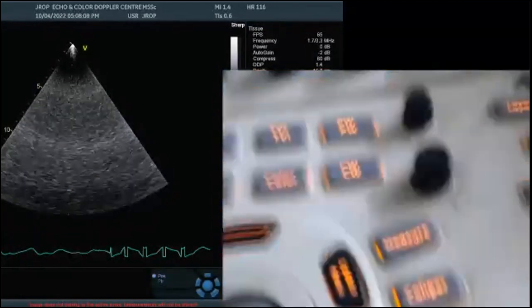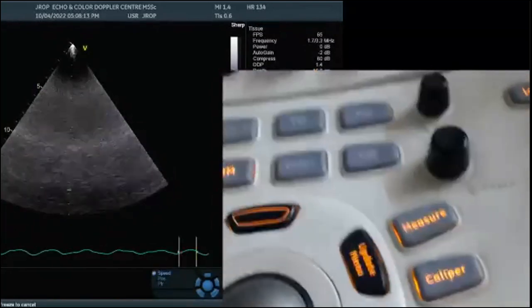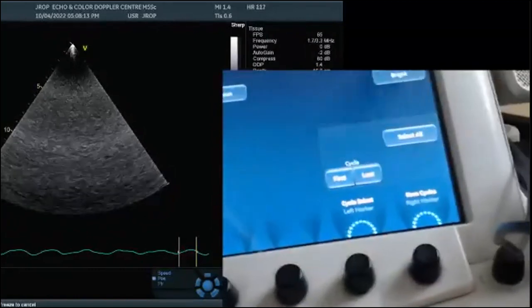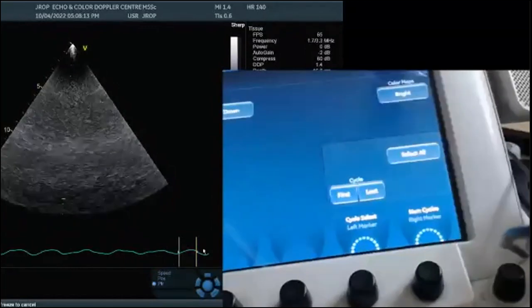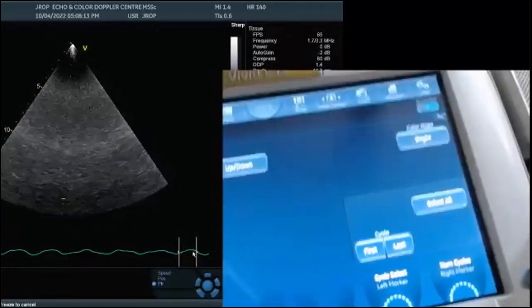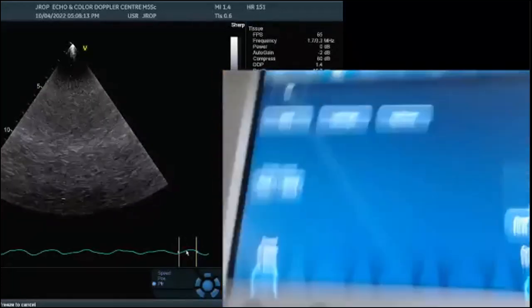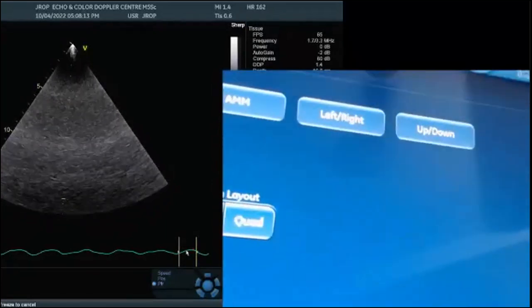Then finally the image to be stored. So we talk of storing of an image. If I store this image over here, look on the screen, there is an image which shows that you have interrogated or stored this in the images. With these few initial happenings, let me go and freeze for a second and then show you a live demonstration for the time being.